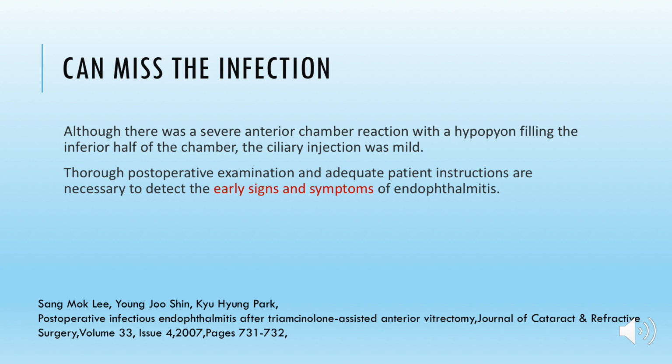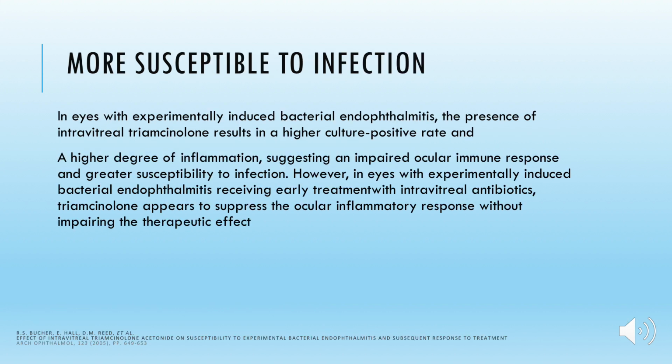Hence, one should be very wary about all these things if one has used this drug to stain the vitreous, and the eye becomes more susceptible to infections. We all know the use of steroids makes the eye more susceptible to infection.